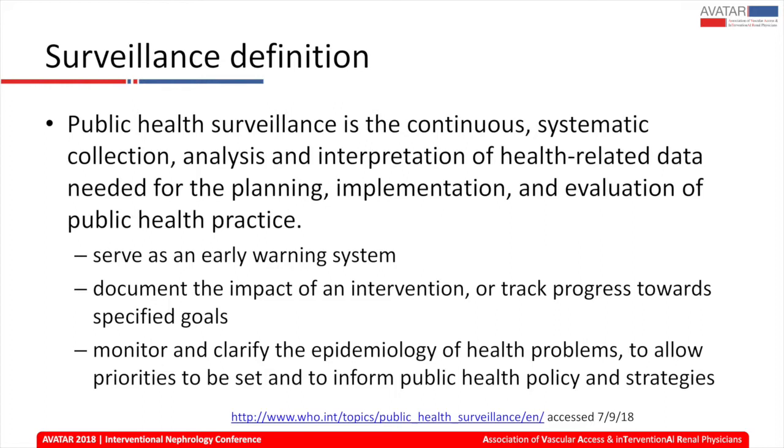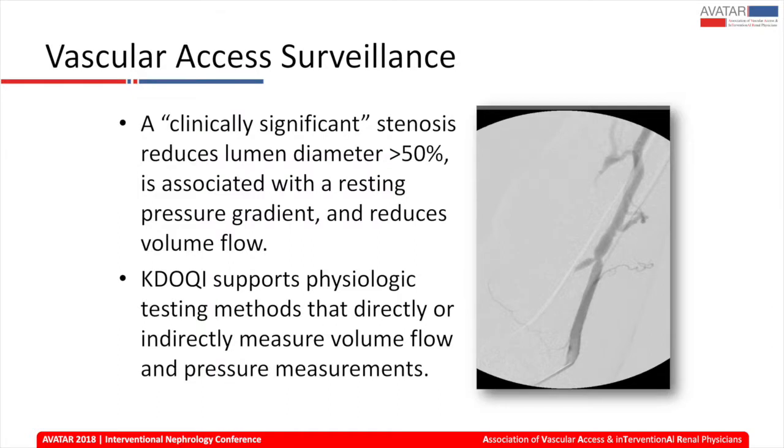But what we have not incorporated in these surveillance programs is an impact on the interventions, because we have given a pretty much clean sheet to the procedures that we do. We don't really quantify whether they have been effective or not, or have specified goals. When surveillance programs for vascular access came into existence, the specified goal was to prevent thrombosis. That was an intermediate clinical outcome. But now we have to move beyond thrombosis into access life and access patency.